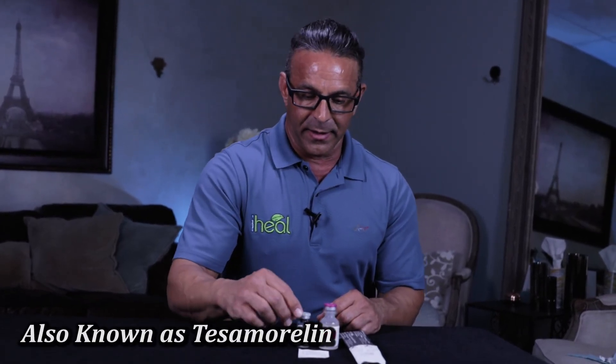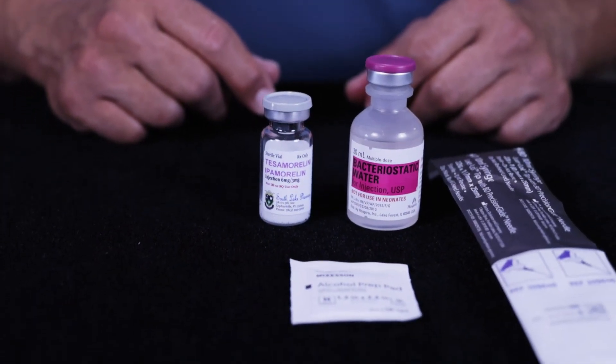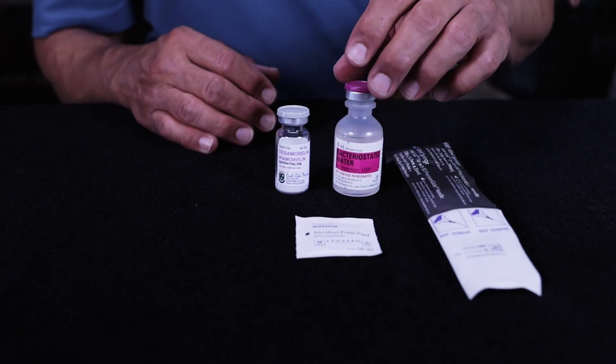I'm going to demonstrate how we're going to reconstitute our peptides. This particular one we have today is Ipamorelin, and these are the products they'll send you in your kit to do it. It's a simple process and there will be instructions included in the kit, but you can use this video as a reference.